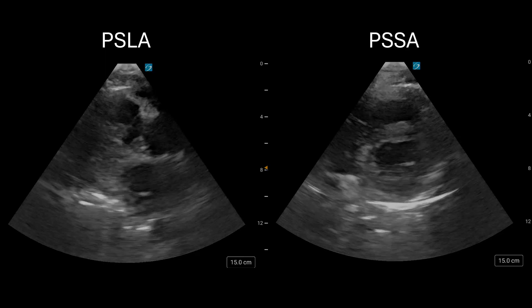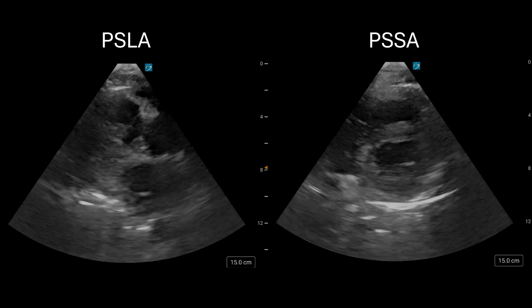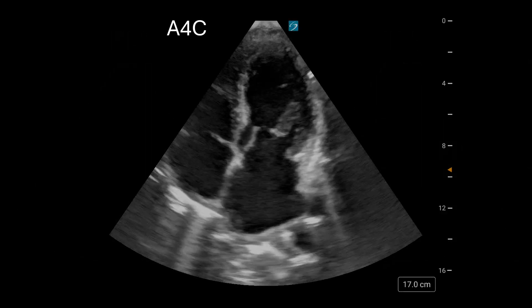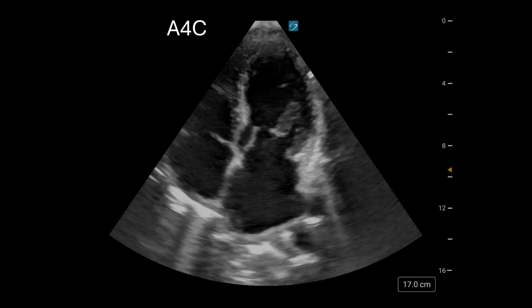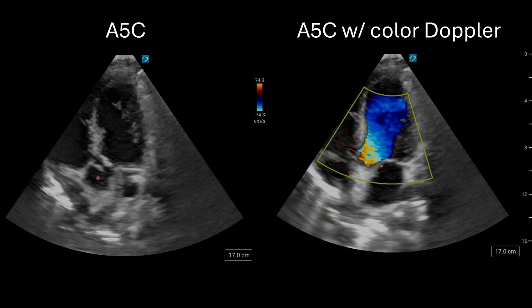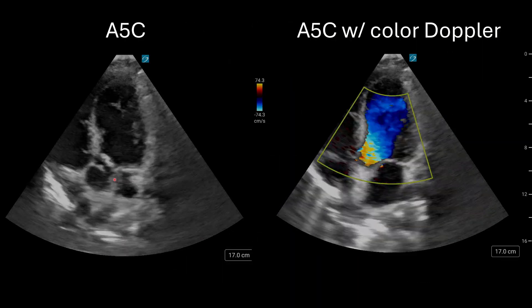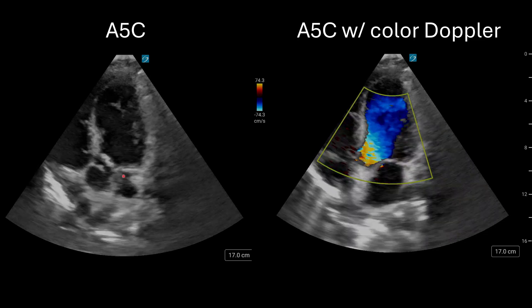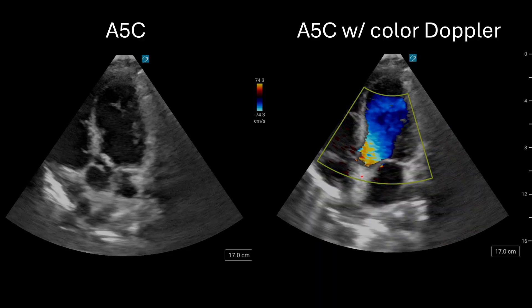Look at her echo. The parasternal long and parasternal short axis look fairly normal at first — normal ejection fraction, no pericardial effusion, and no right heart strain. Now look at the apical 4-chamber view — still looks fairly normal. But if I tilt my transducer to obtain an apical 5-chamber view and look at the aortic valve, notice that the aortic valve leaflets are not coaptating or coming together. This is a big problem.